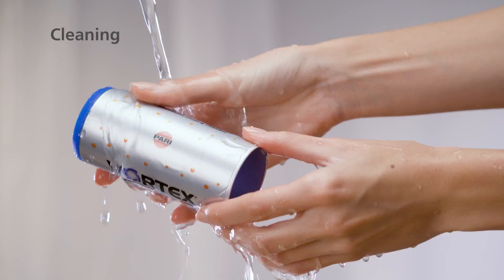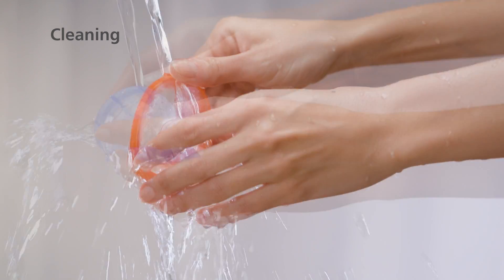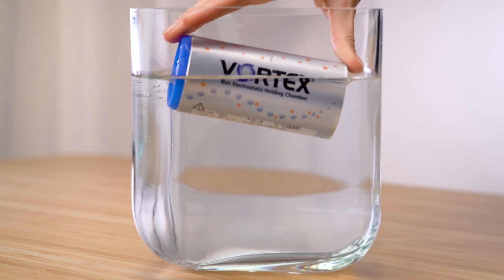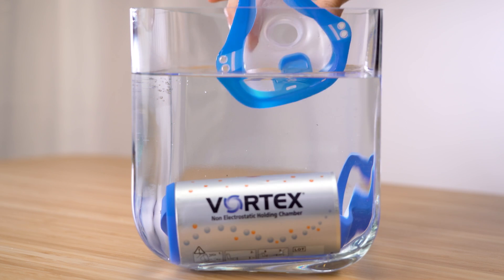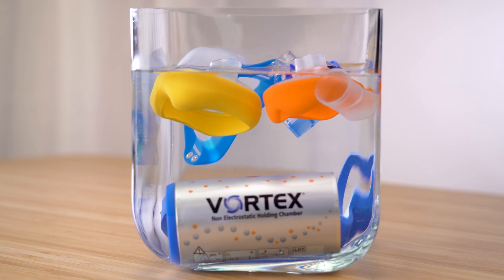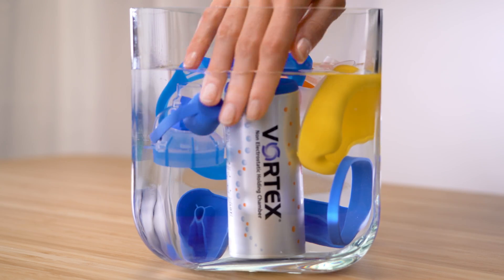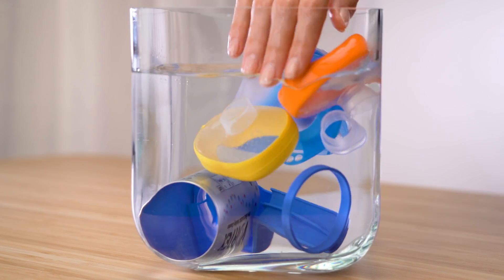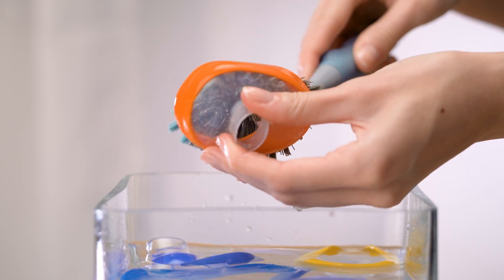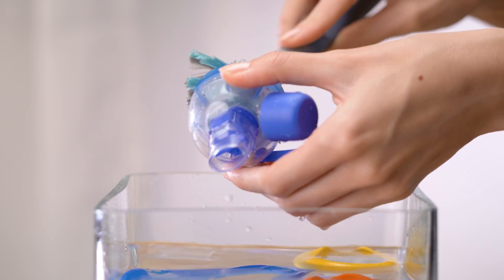Rinse the Vortex parts you have used in running tap water for about two minutes. Fill a bowl with water and add a little washing-up liquid. Soak all the individual parts in the water for about five minutes. Occasionally move the parts back and forth. To remove any visible dirt, use a medium soft brush reserved exclusively for this purpose.